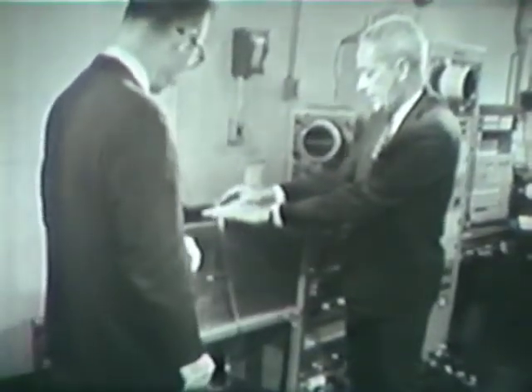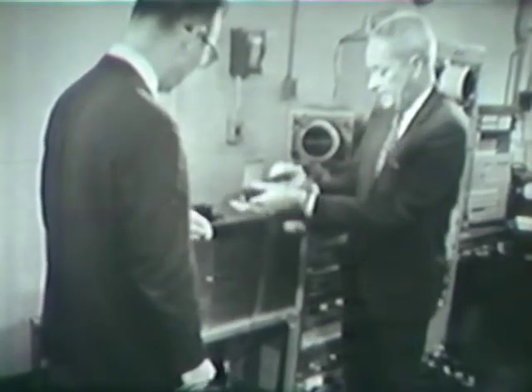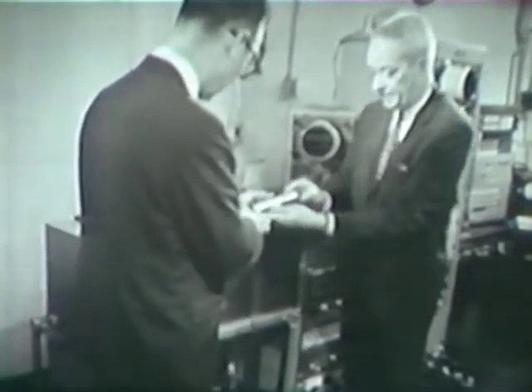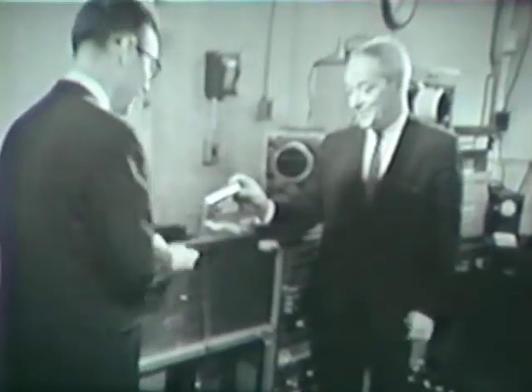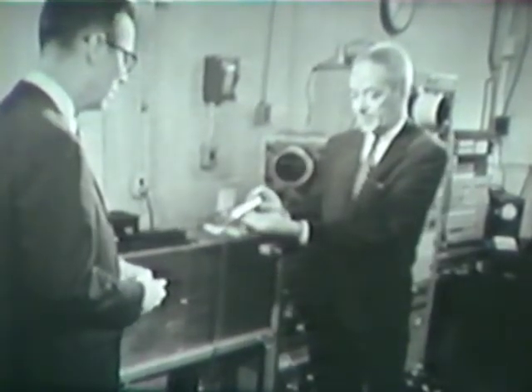Here's a thing called a carriage, and we've cut a piece out of the page of a book. This is an honest sample of book print. We're not cheating. We didn't have this specially made up. Not much of a plot. No, but we want to look at realistic material. And we've arranged it this way for purposes of testing the system.